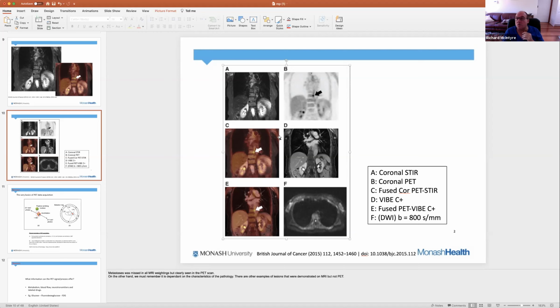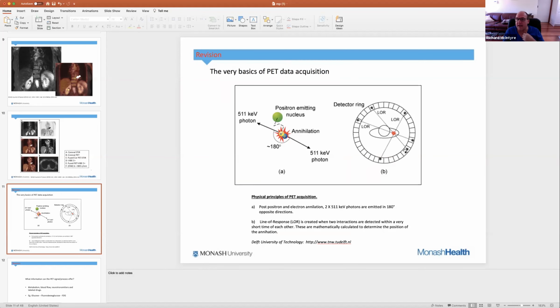They can inject other molecules like a bone scan. They can inject, say, osteoblasts or whatever they call them and bind them with radiation so that when the body tries to repair itself, it uses more of those metabolites, I don't want to say chemicals, uses more of those cells. And then because they're bound with radiation, you can see in the body where there's a subtle fracture because they've taken up those drugs or those molecules to help the bones repair themselves. Okay.